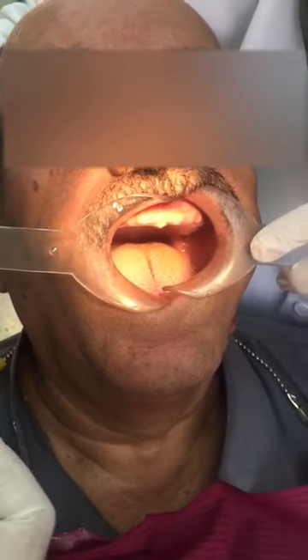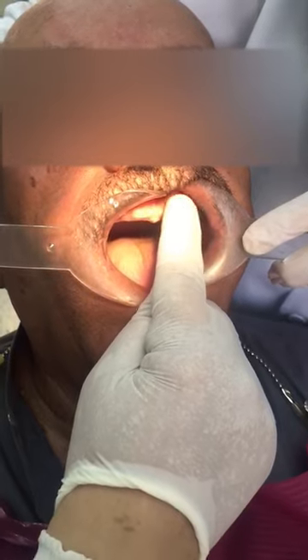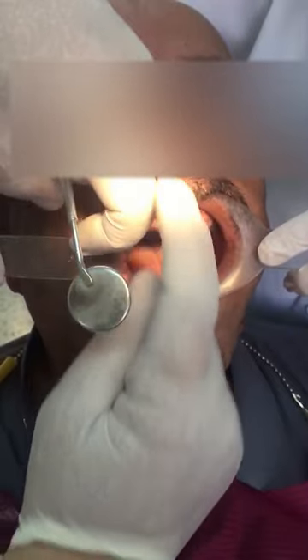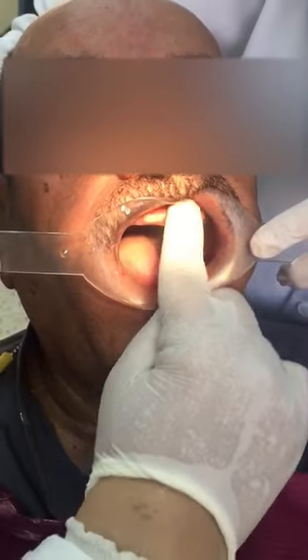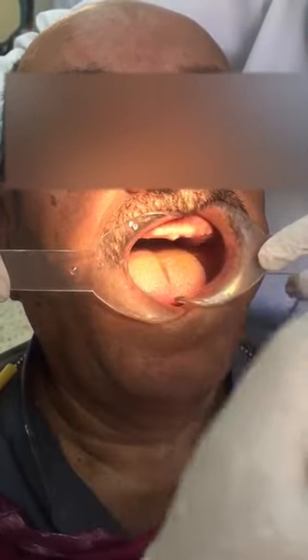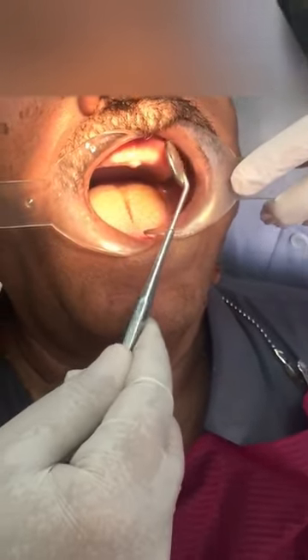So if you are going to use your finger — suppose this is an undercut — if my finger can feel it but you slip away and there is no retention, that means it's shallow. But in this case I could put my finger and feel resistance; I could not go downwards. I feel resistance because it's deep. If I'm going to take a surveyor, maybe more than 8 millimeters depth of undercuts — so that's a deep undercut.